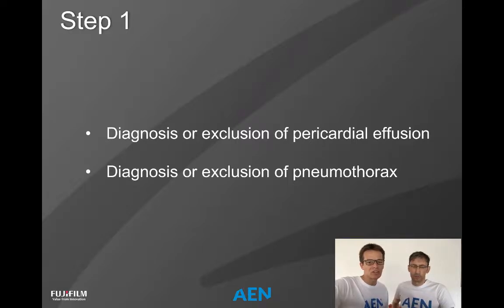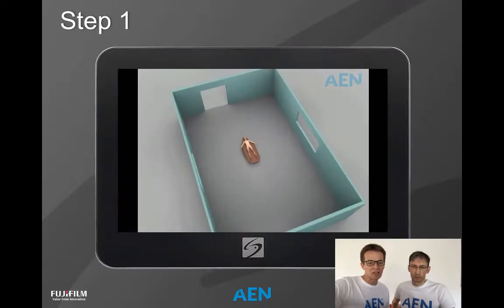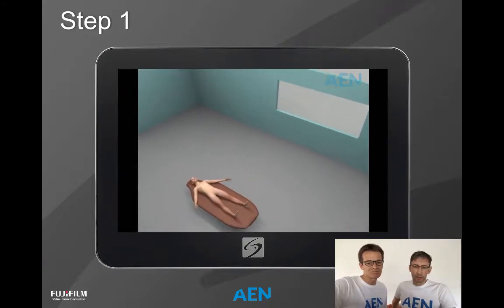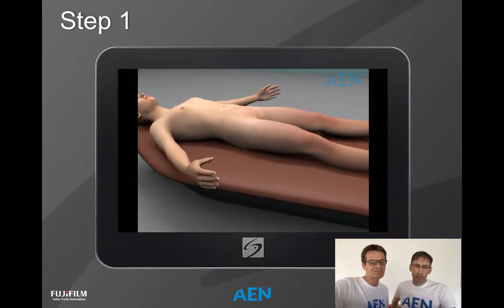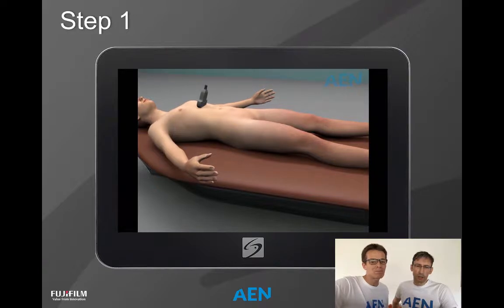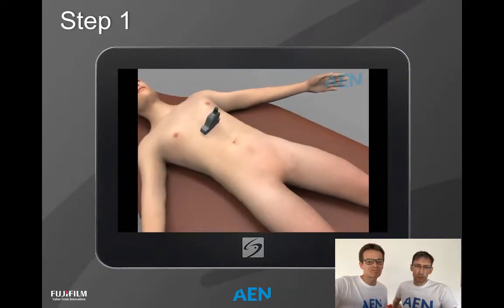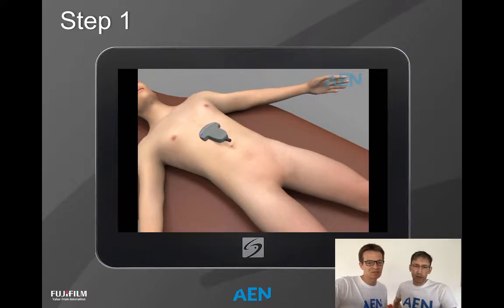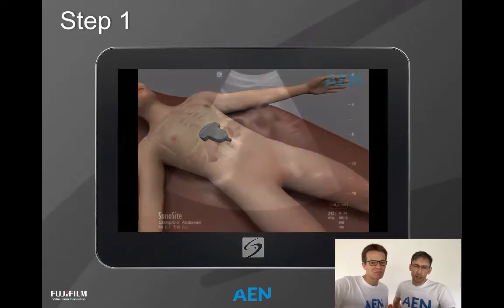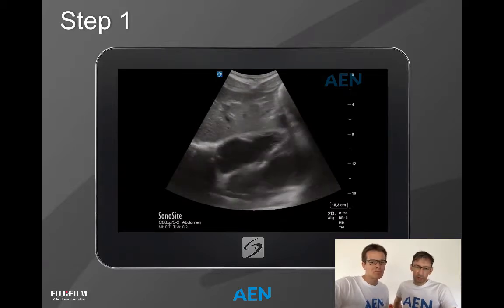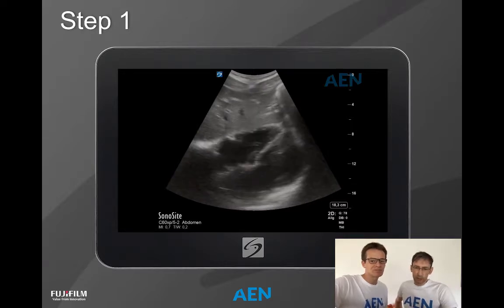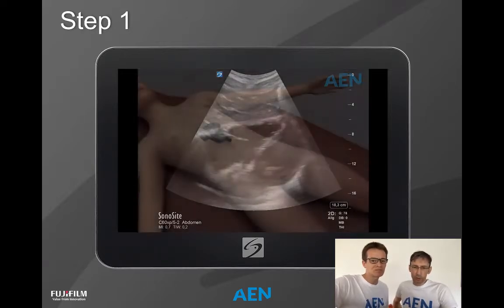Step one is to look for pericardial effusion and to try to rule out pneumothorax. In a typical emergency room situation, we approach the probe in the subcostal position. We tilt the probe and try to find a good view in order to diagnose the heart. This is the ultrasound picture — the hypoechoic region of the heart — and here we can exclude any effusion.